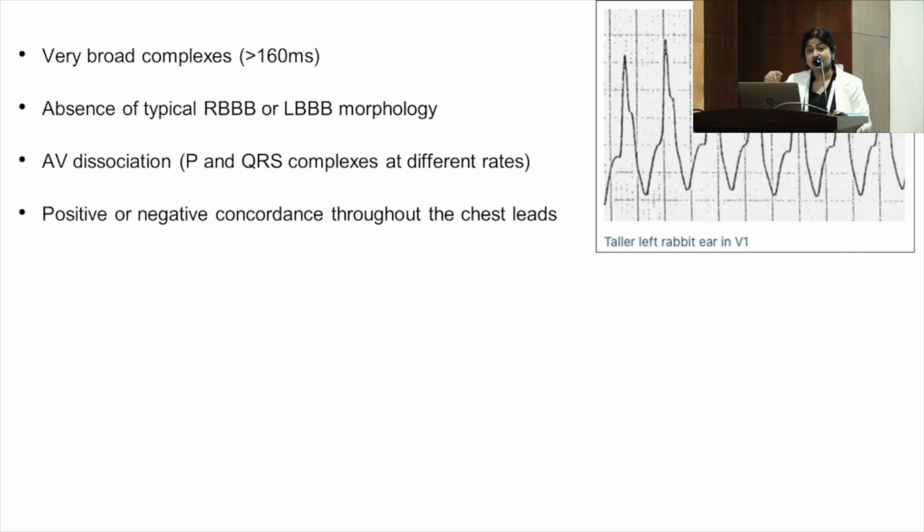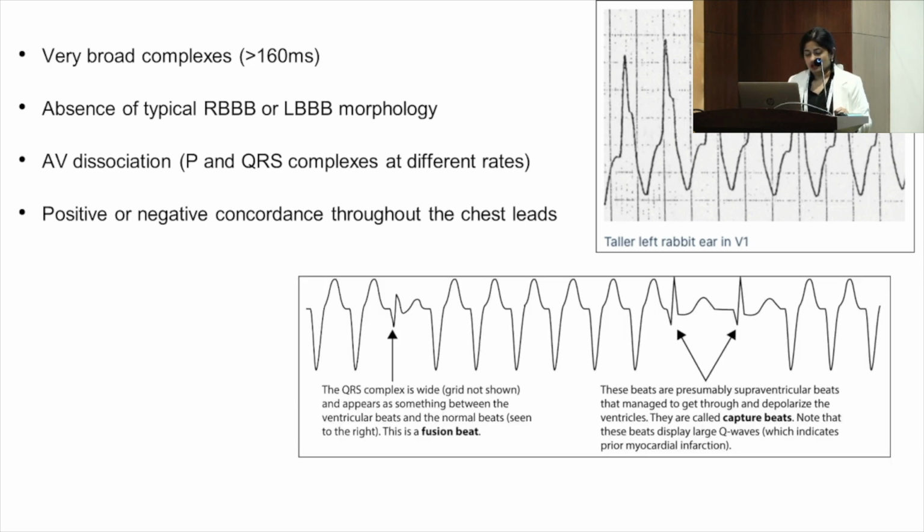Like you can see here, you are able to see the two waves, right? What happens in RBBB? The left rabbit ear is taller. Sorry, right rabbit ear is taller. Here what you can see is the left rabbit ear is taller. Then fusion beats, capture beats.